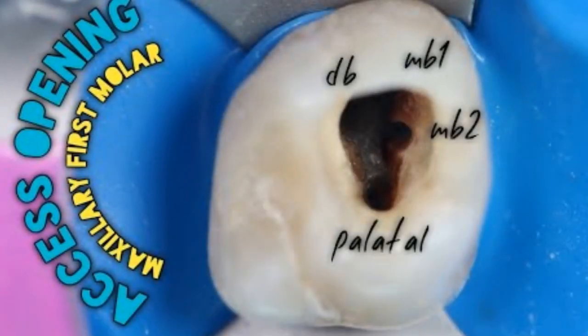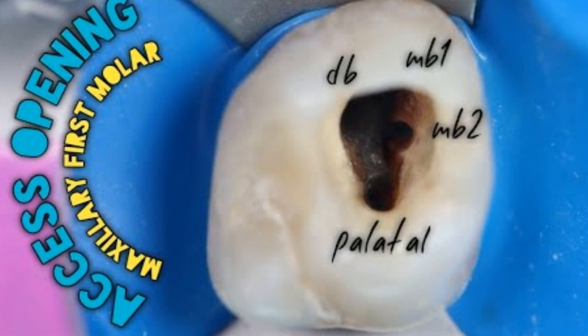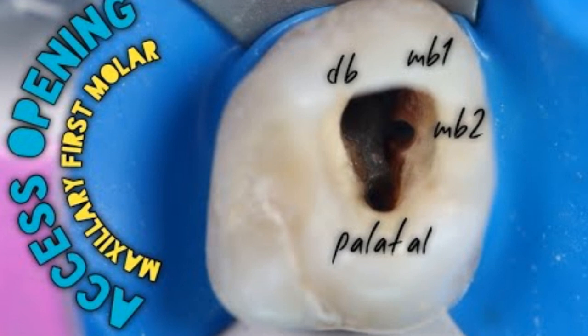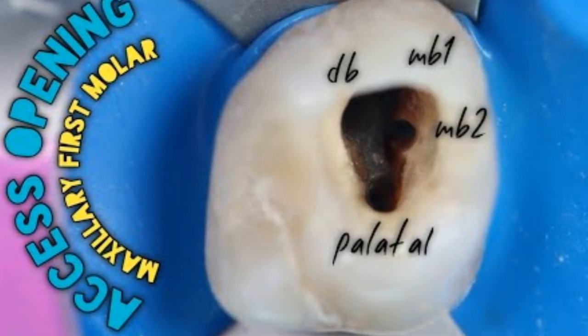So as you can see, this patient has 4 canals. 2 MB, which are MB1 and MB2, joined together, as you can see, and one distobuccal, and one palatal. As you can see, the widest canal there is the palatal canal.